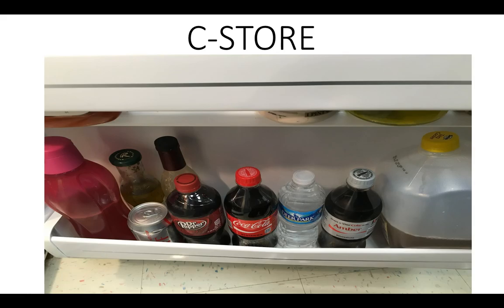C-store. So I've decided not to have my Coke right now. I need to store it someplace until I'm ready to drink it. Basically, I need to store it in the archive. I can use C-store to put it in a specific place in the refrigerator so I know right where to get it when I want it. I will use C-store to transport my DICOM object to the fridge. And there you see my DICOM object is stored in the archive with all the other DICOM objects.